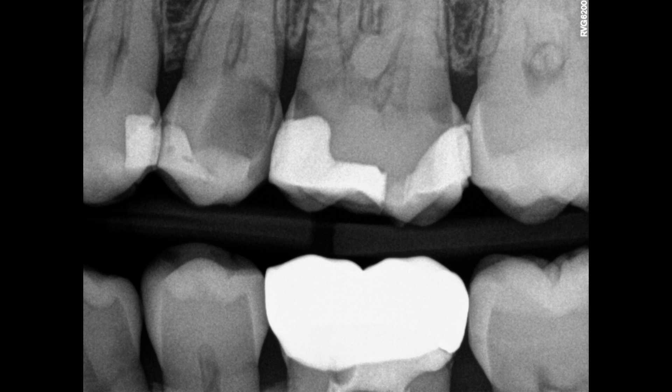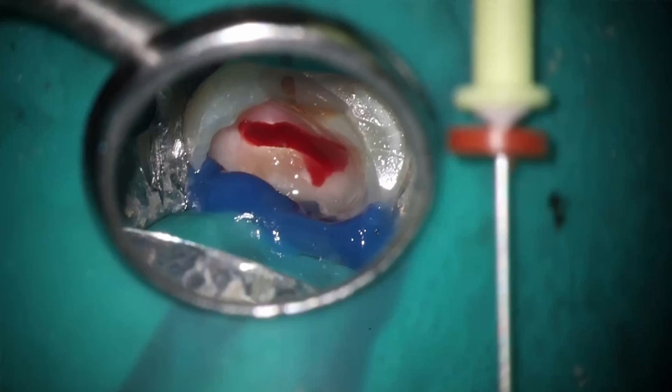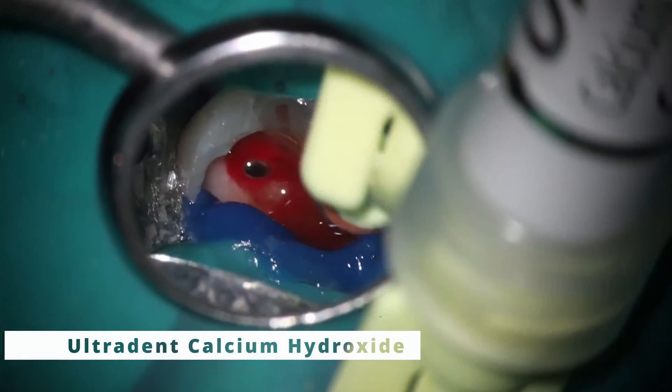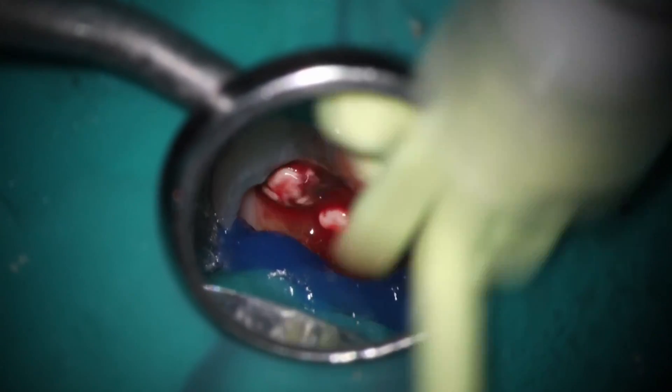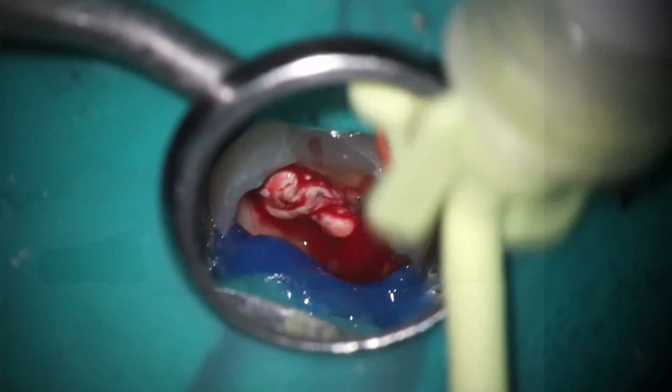The tooth was in a lot of pain, but I cleaned everything out and was unable to get it dry initially. So this is what it looks like. What you do is take calcium hydroxide, place it into the canals, and then use paper points to go up and down and push it all around in there.